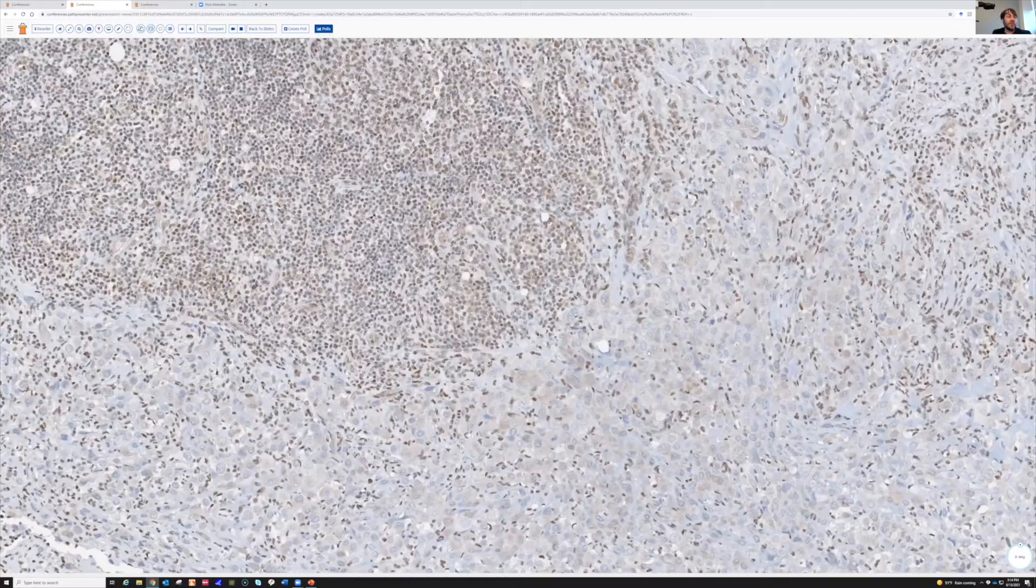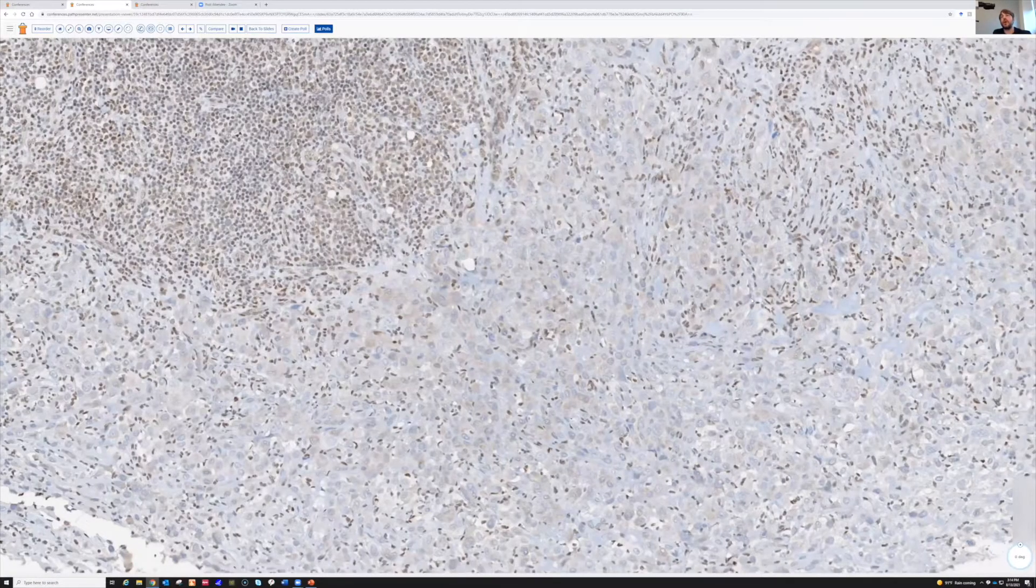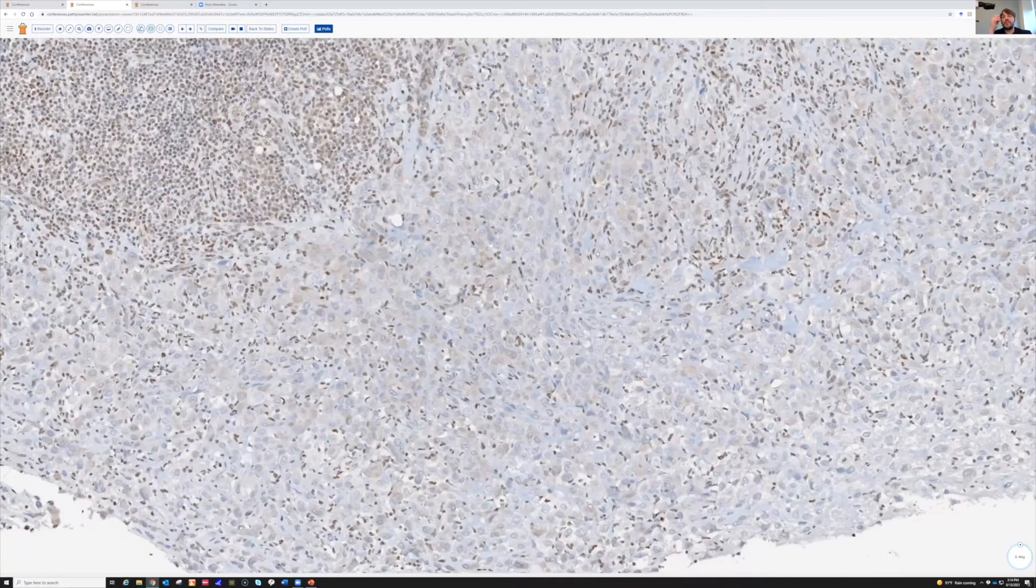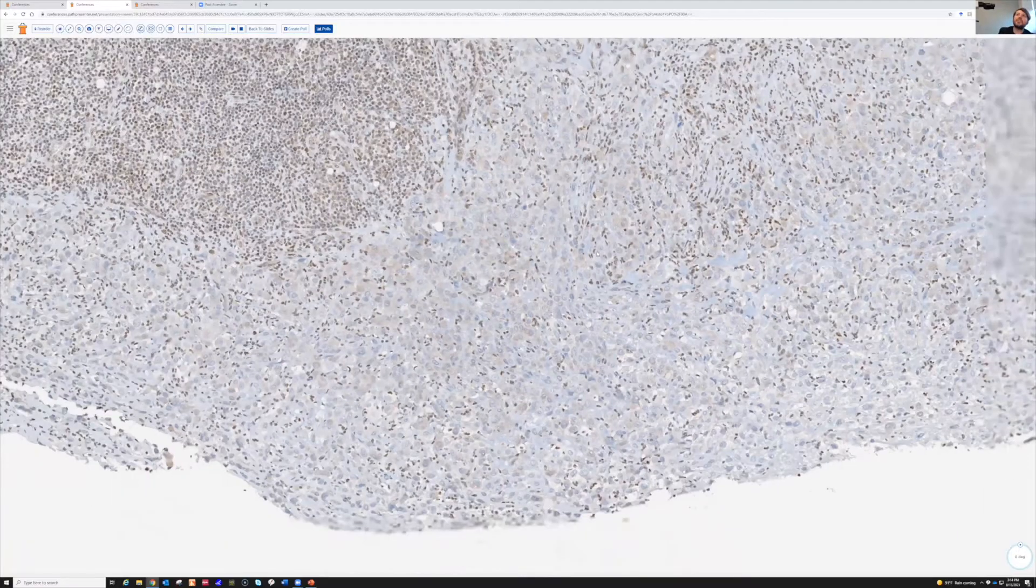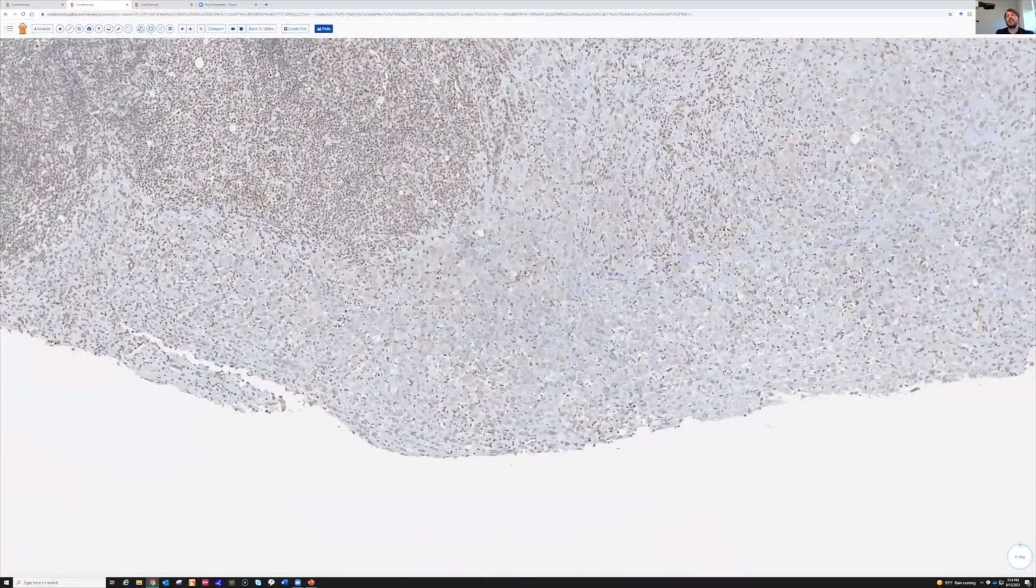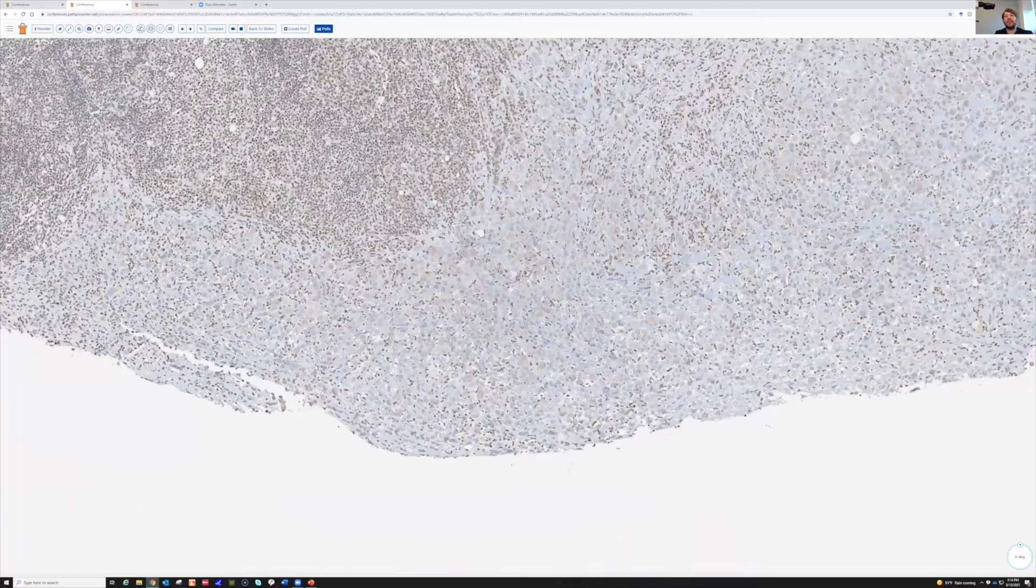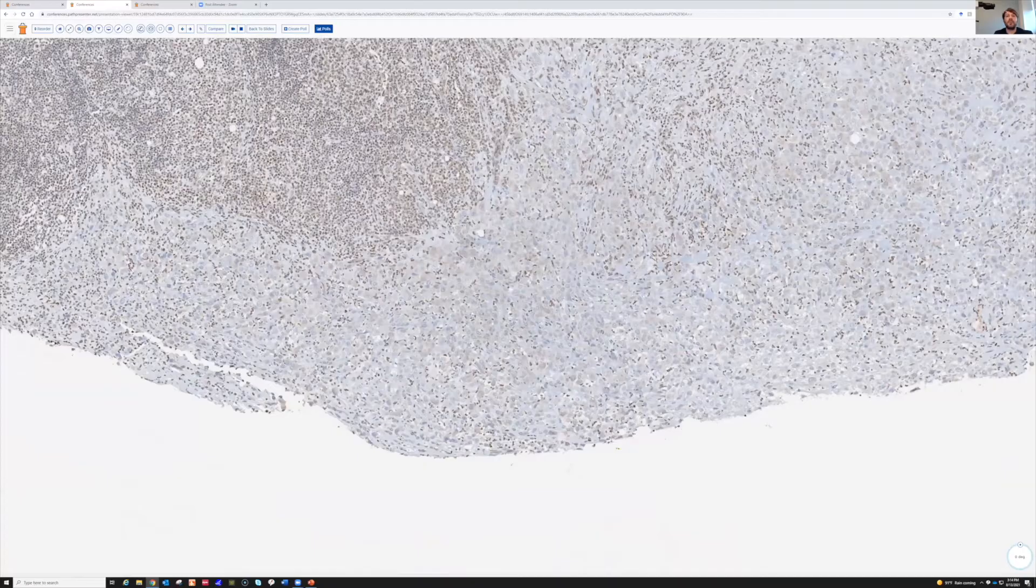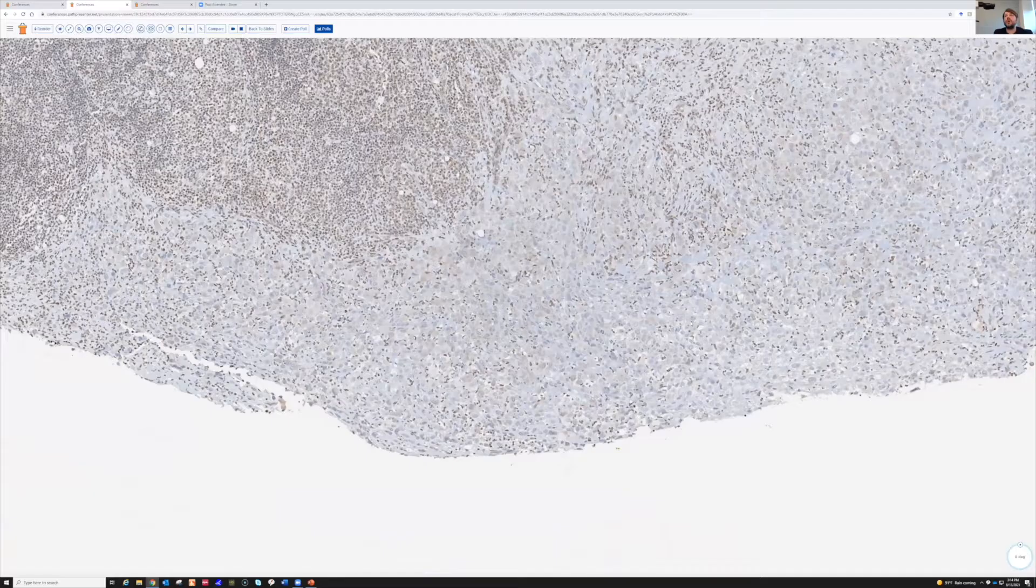So this tumor is, of course, epithelioid sarcoma. And these often arise on the distal extremities of young adults, the conventional type. There's also a proximal type that is more ugly and kind of rhabdoid looking, very obviously malignant, and tends to occur more proximally, like in the groin or close to the trunk. In any case, these are important tumors to know about.